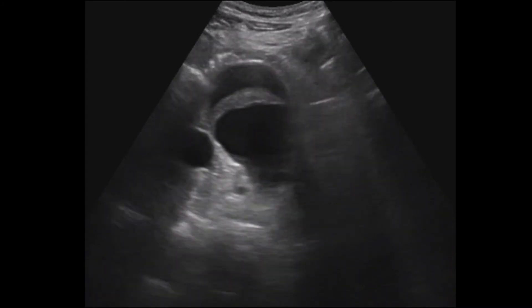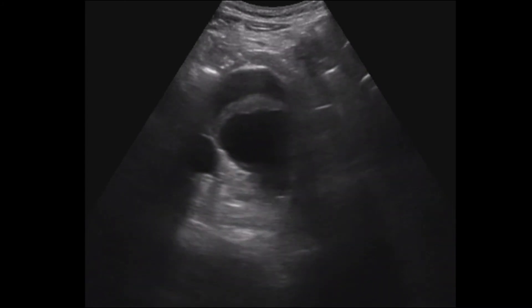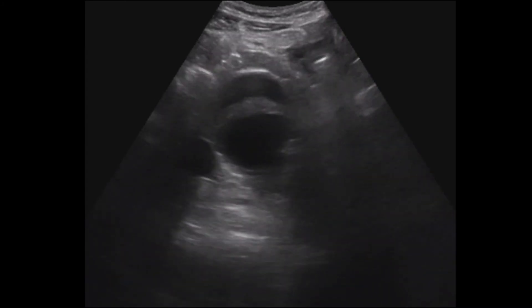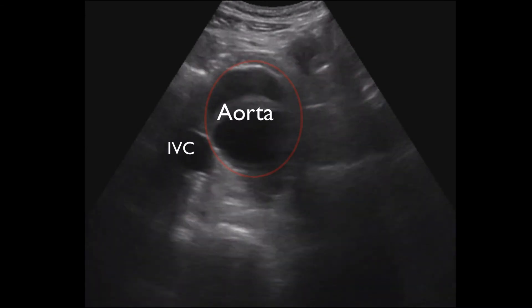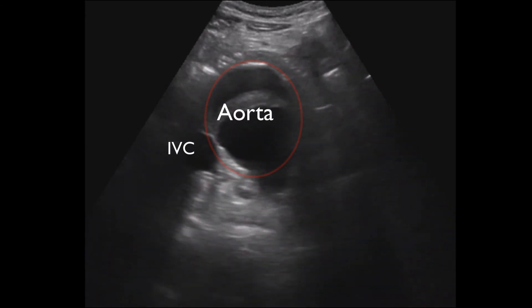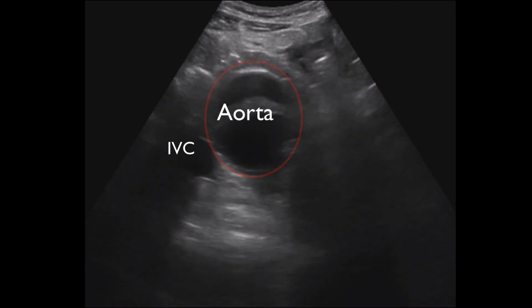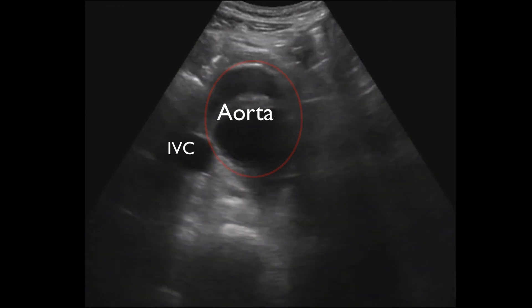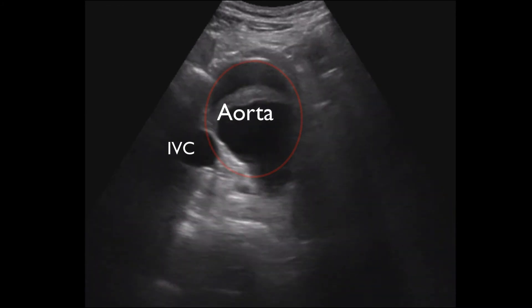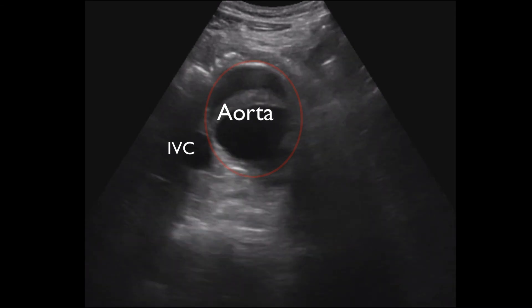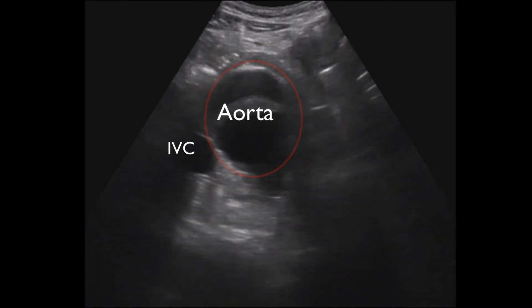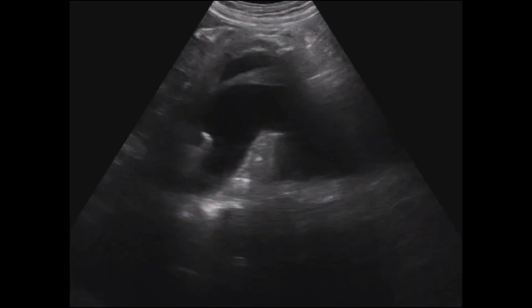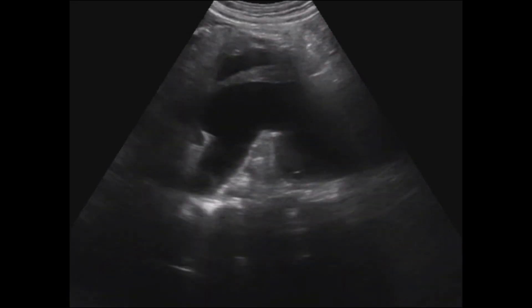Hopefully, based on the images and the chief complaint, you were able to determine the location of the structure and the abnormality. As you likely have determined, this is a transverse view of the abdominal aorta. The aorta is a large pulsatile structure with echogenicity within the lumen. The classic landmark of the vertebral body is difficult to visualize, yet the IVC is clearly visualized to the left of the aorta. Here's a second view of the aorta, giving a slightly different orientation and representing a more distal image as we can see the iliacs coming into view.